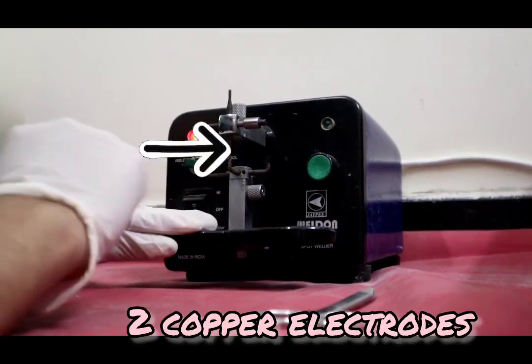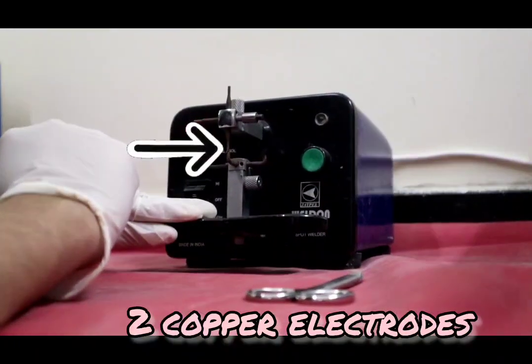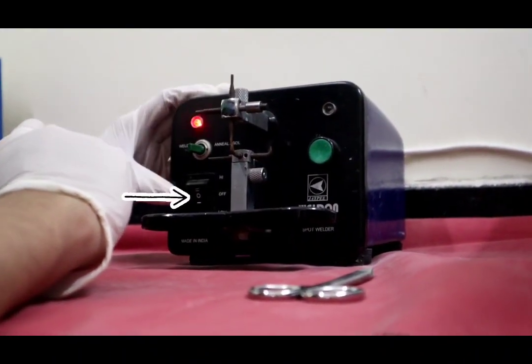Coming to the different parts of the spot welder: it consists of two copper electrodes which are present in contact with each other. The two metals which are supposed to be joined are placed between these two electrodes. This is a switch.